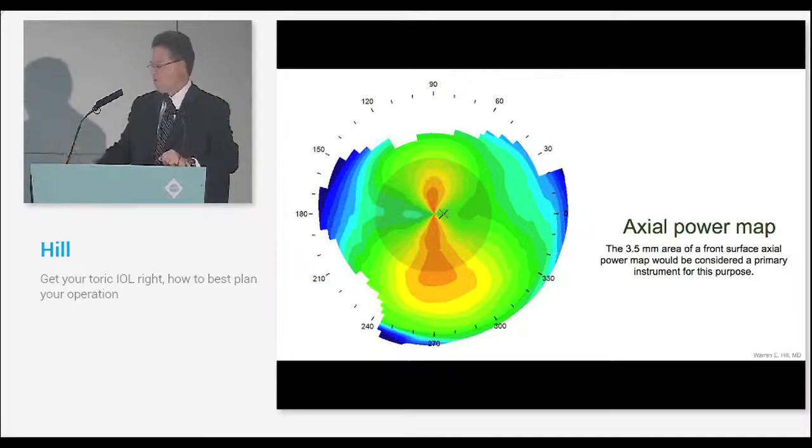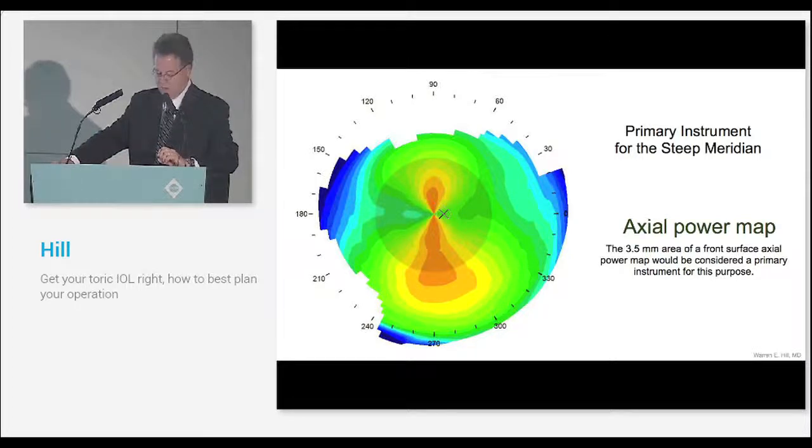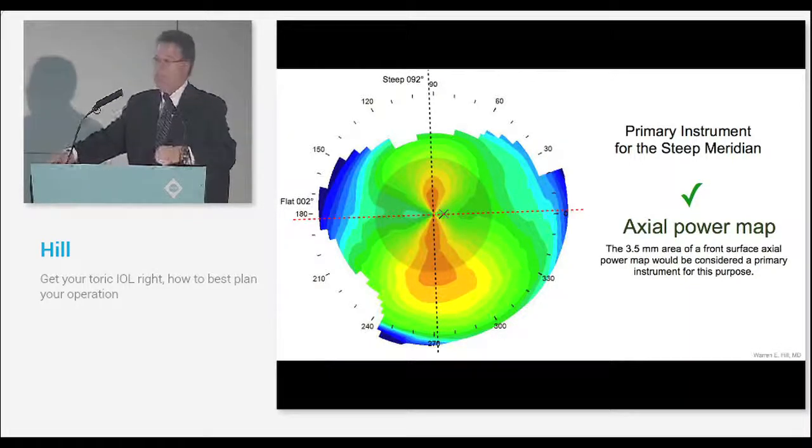They straddle the corneal vertex. And if we were to draw a line through the corneal vertex and through the center of the two lobes, and we see where that intersects the axis scale in the periphery, that can only be the steep meridian. It can't be anything else.